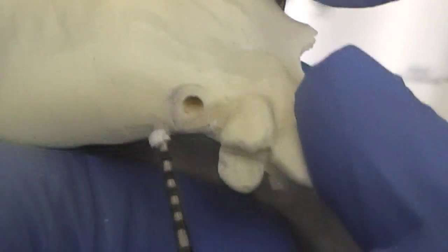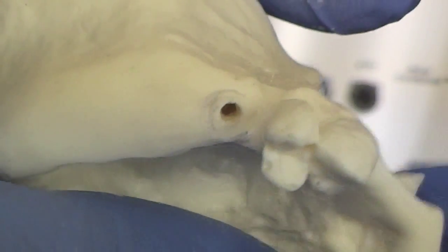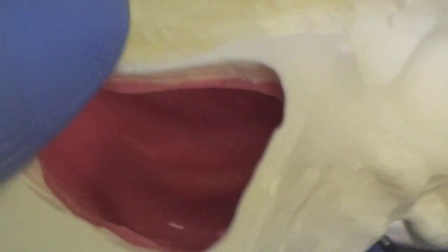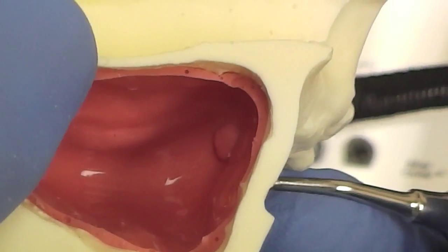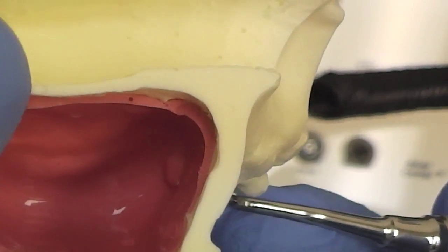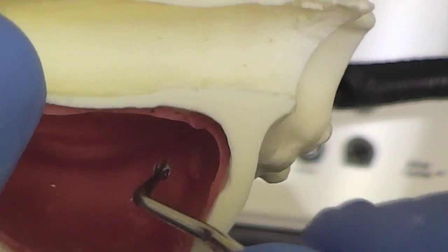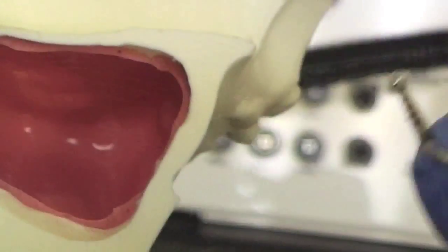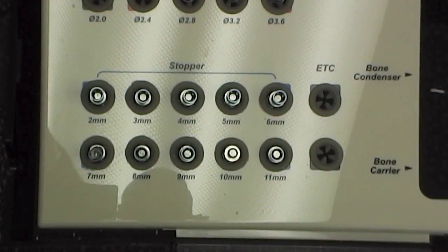Now, one of the things we can do, which we can't do on a real patient, is put the membrane tester in place, lift it up, and you can see, there we go. So we lifted the membrane up inside. You can see the difference between this little bump right here and the other side where that's clean. So we have achieved lift at 10 millimeters.